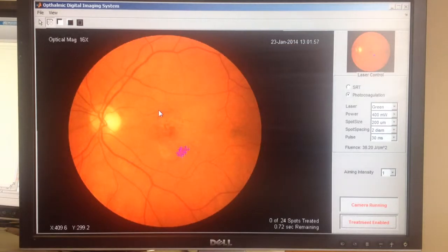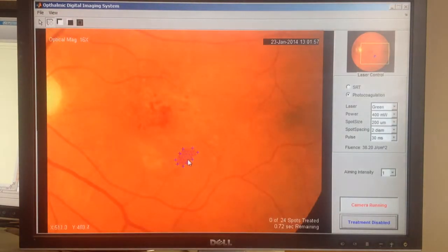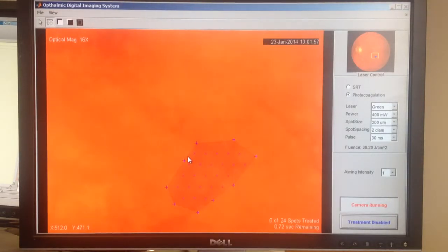What would the scanner be doing with its aiming beam? So the aiming beam is going to be showing you where it's going to be treating. Wherever there are spots that haven't been treated, the aiming beam is going to show spots that have not been treated. It's going to show the queue. We've even discussed where it might highlight the next 5 or 10 points if you wanted to subdivide this out. It's always showing the queue, like what's going to be treated, what needs to be treated.